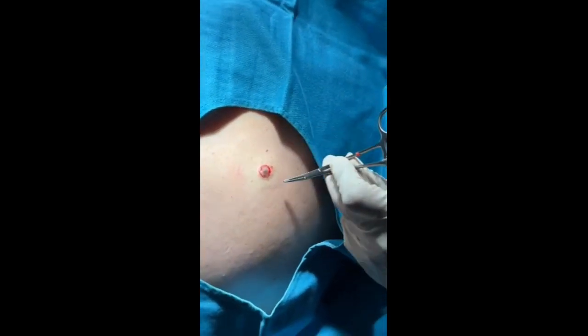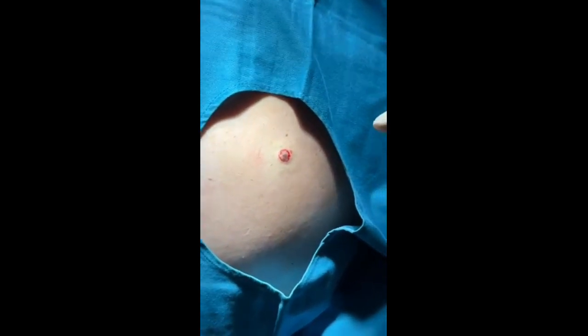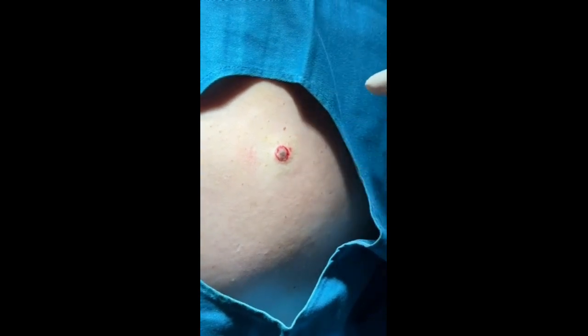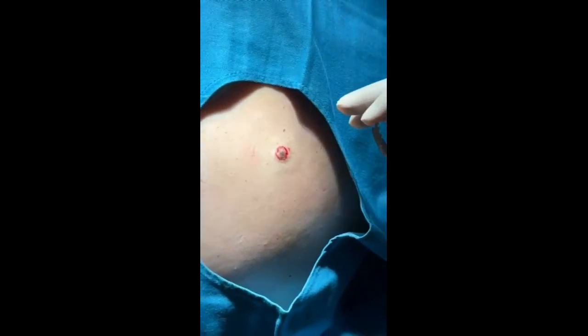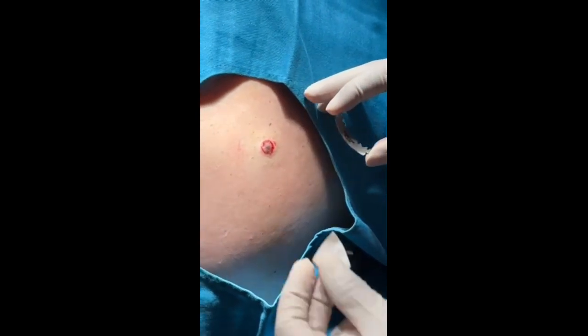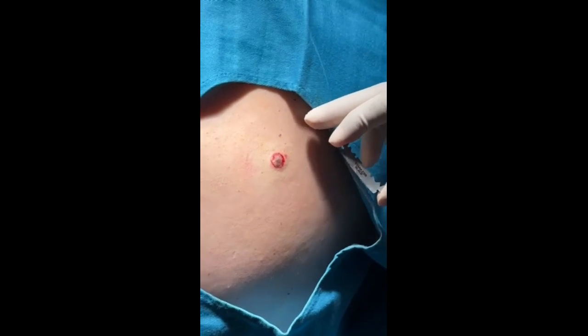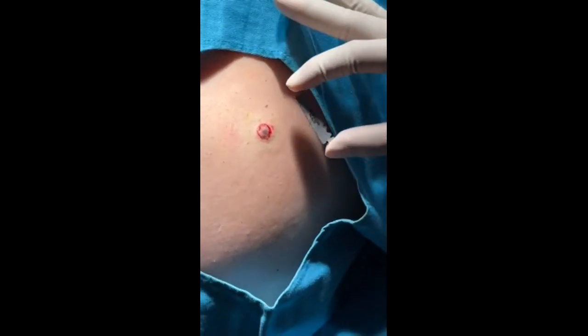We call it a field block, using lidocaine — one percent lidocaine solution with epinephrine. Once the area is numb, it's about a seven to ten minute waiting period. You can see the blanching of the skin; there's no more oozing.